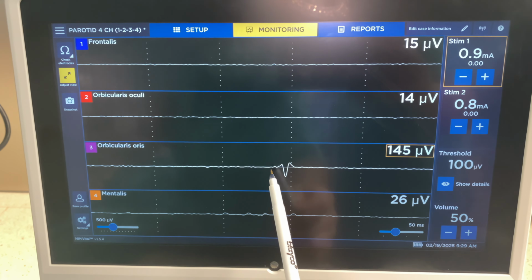Okay, all right, good. This is parotid tissue. This is subcutaneous fat. This is parotid fascia. In this area, we're very safe. Okay, bone, sternomastoid. So you want to expose bone right there, and you want to expose sternomastoid. Okay, now, look, put your finger in there, feel that. Okay, nice and open. There's the jugular vein. Yeah. You put your finger in there, you feel the carotid pulsation, but look how nice that is, okay?